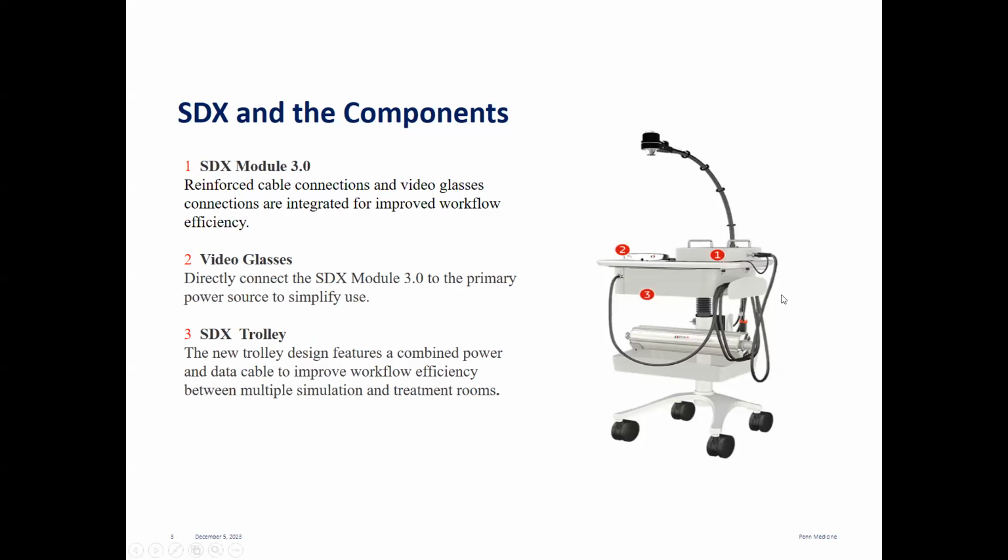The device labeled 3 is the trolley, and it features a combined power and data cable to help improve the workflow efficiency between, like I said, multiple simulation and treatment rooms. At Penn Medicine, we have computer monitors in every room that have the SDX software and can connect to the system.